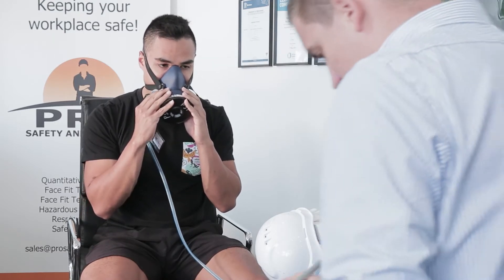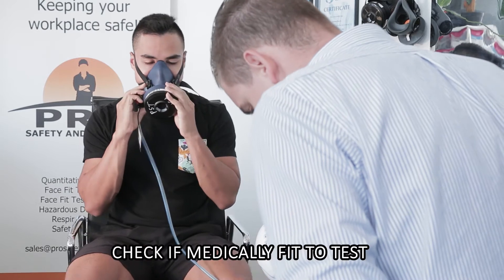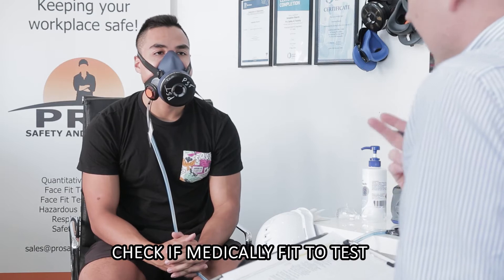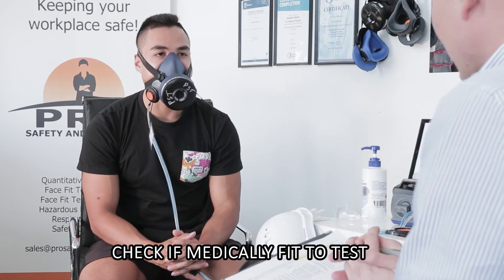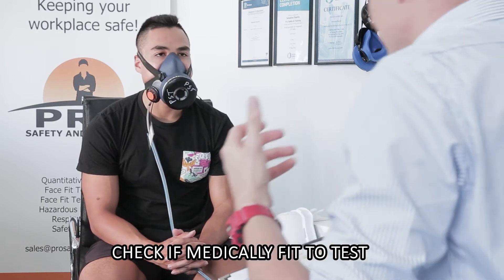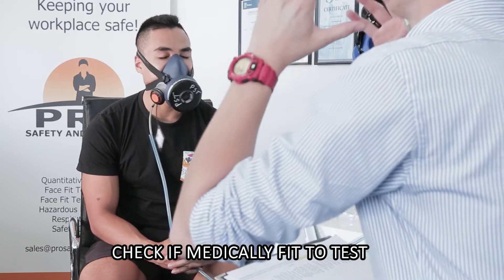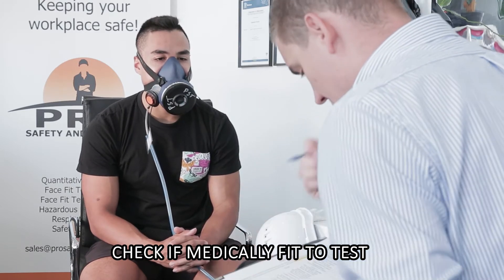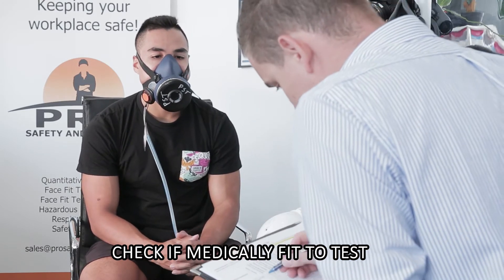Operator initials — that's myself. Now James, first question: do you feel medically fit to test? No anxiety from wearing the mask, difficulty breathing, stress from wearing the mask — you're okay to wear the mask? Excellent. You don't have any back or neck injuries that would preclude you from doing the fit test, no injuries bending over or putting your head side to side or up and down? You're not anxious with the mask on? You feel comfortable with the mask on? Excellent. So medically fit to test — that's great.